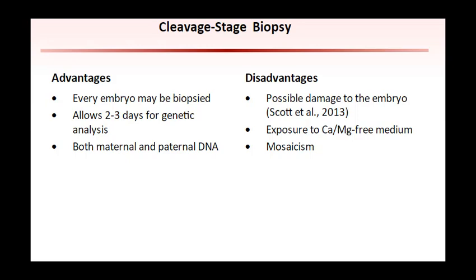Unlike polar body biopsy that samples only maternal DNA, cleavage-stage biopsy samples both maternal and paternal DNA in the embryo. Research has shown that cleavage-stage biopsy may significantly impair implantation and live birth rates. It is recommended that cleavage-stage biopsy be performed while the embryo is exposed to a calcium and magnesium-free medium. Cell-to-cell bonds are mediated by calcium, so removal of calcium from the medium allows separation of the blastomeres, which lends itself to an easier biopsy.